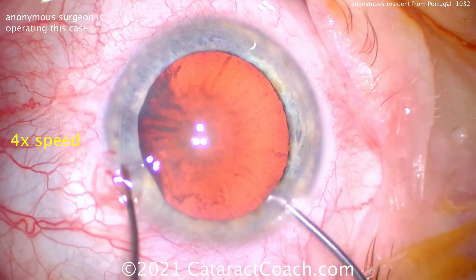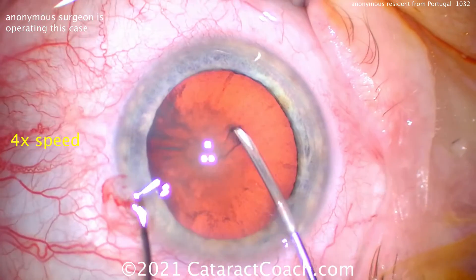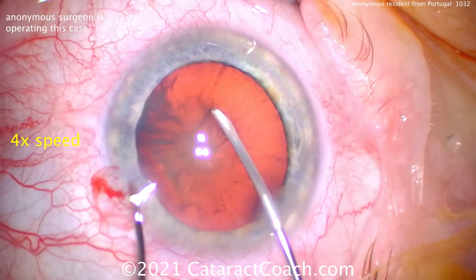That incision is way too short, way too fast — not good architecture. You have got to do a better incision.